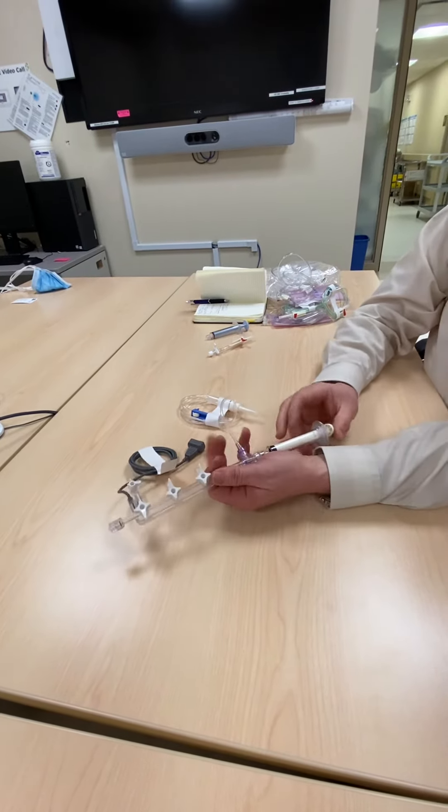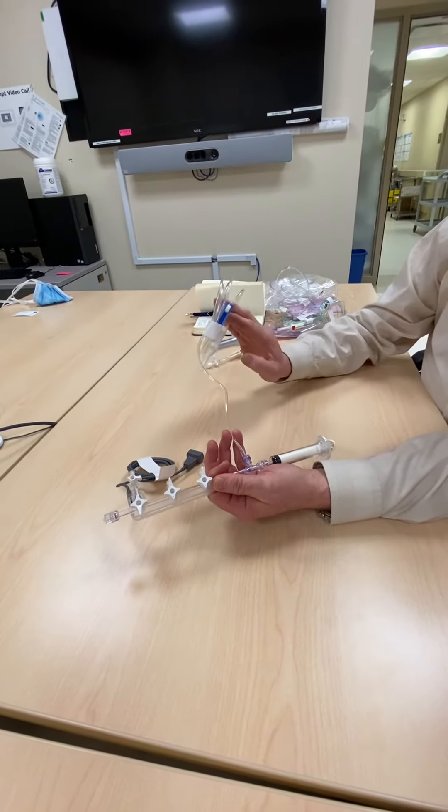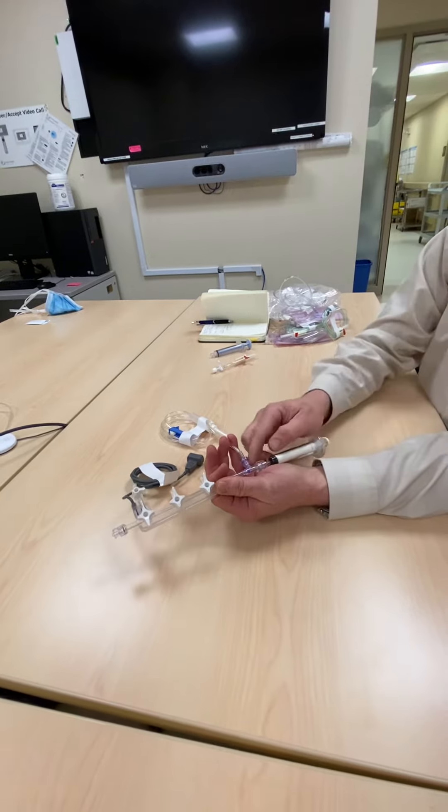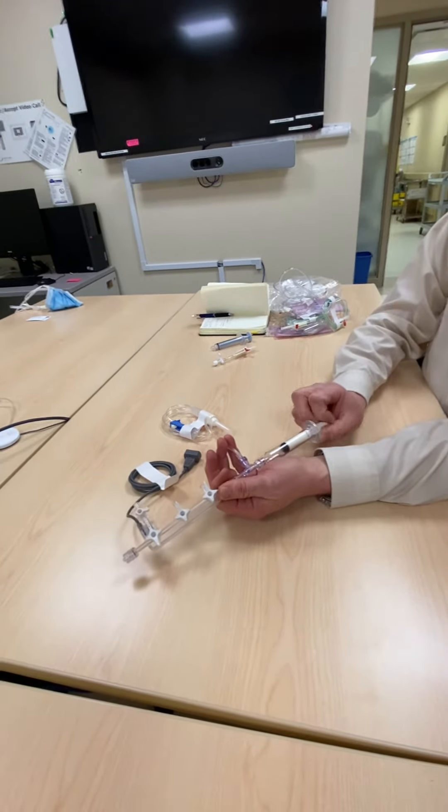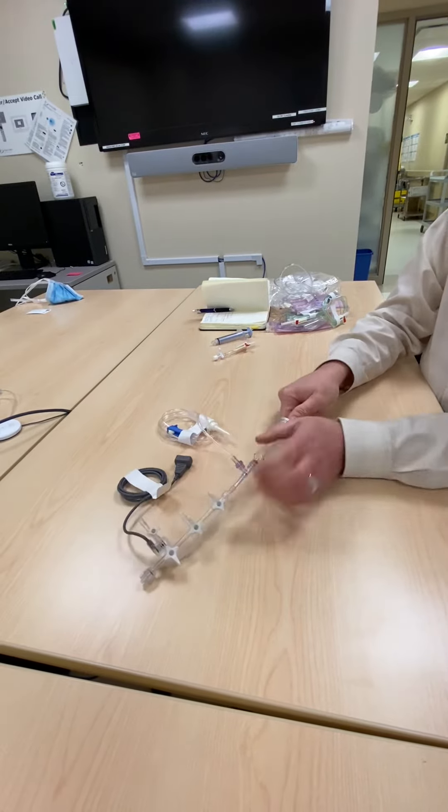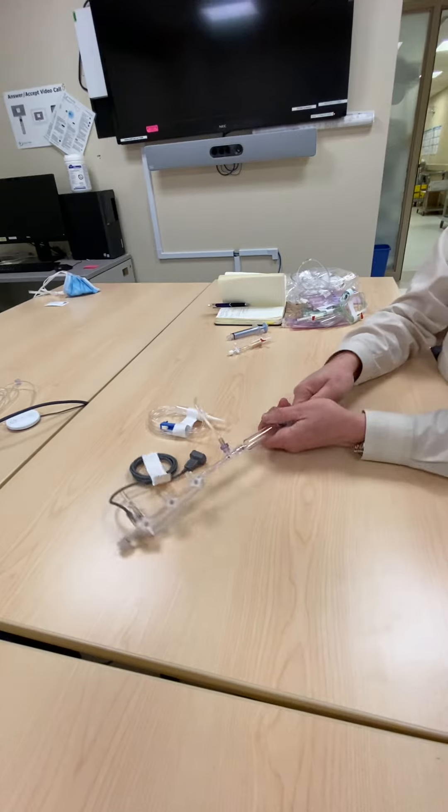On this end, what we have is a couple of one-way valves and then we have a line that's going to our contrast. And because of the one-way valves, what happens is that when I pull back on my syringe, it's automatically going to pull from my contrast. It will not allow anything to be pulled from this end.